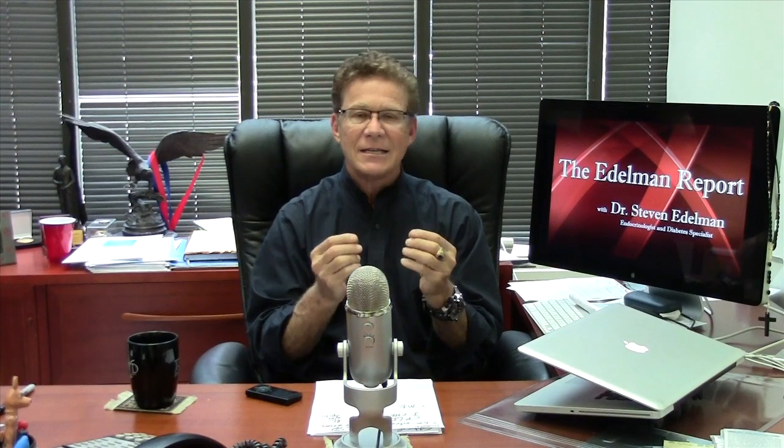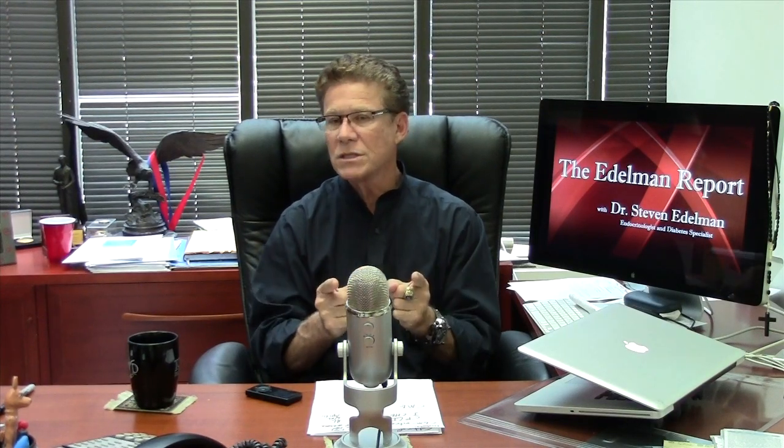Hello Nation. Today we're going to talk about the importance of trend arrows. What are trend arrows? Trend arrows are the little arrows next to our blood sugar when we look at our continuous glucose monitoring device to tell us how fast and what direction our blood sugars are going. I use the Dexcom, others use the Medtronic sensor. I think the best way to explain that is by looking at this picture.